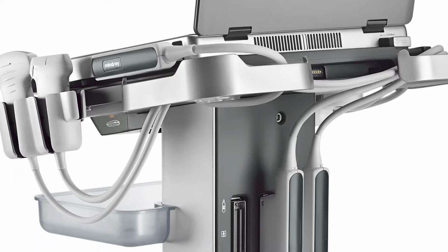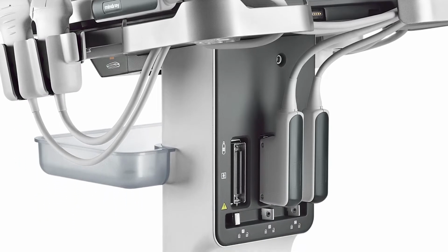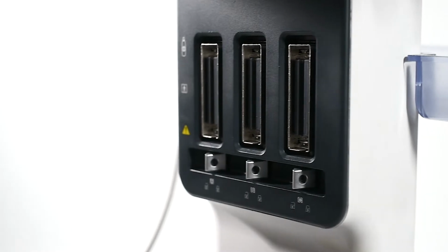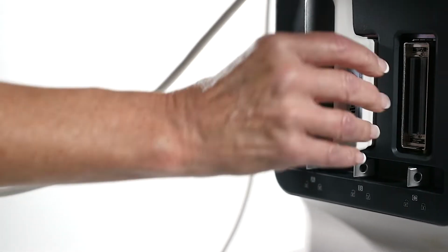There are 3 active transducer ports on the rear of the ME8 cart. To connect a transducer, flip the tab to the left to unlock. Secure the transducer and push the lever to the right to lock into place. It is recommended that the system be frozen or powered down to connect and disconnect transducers.